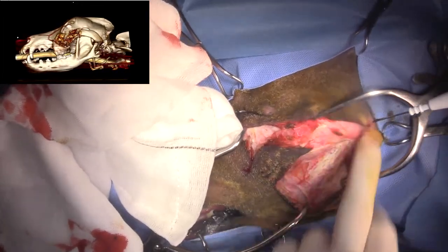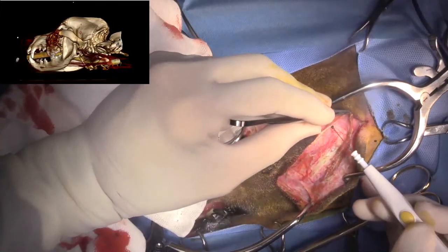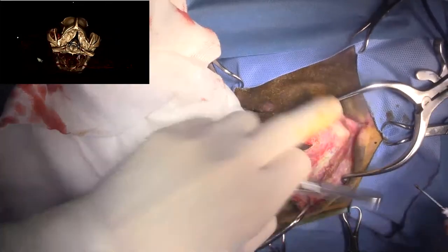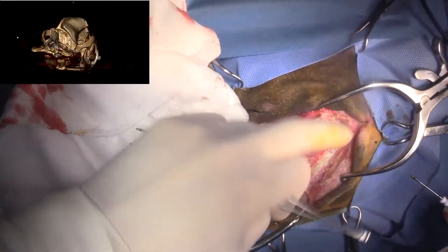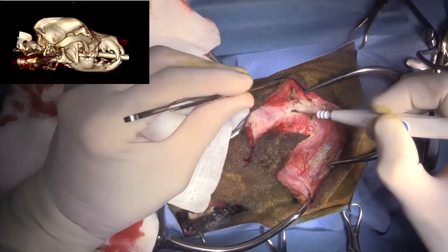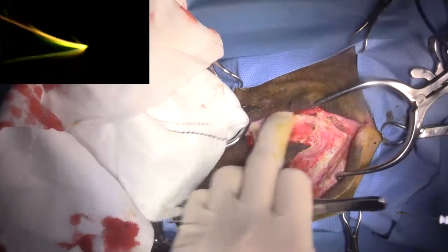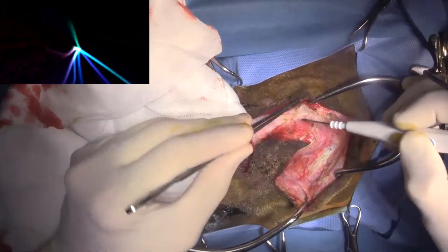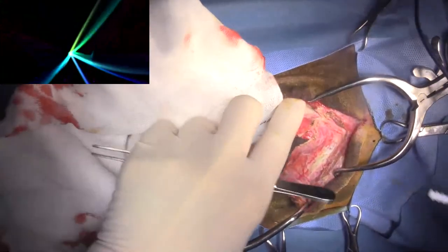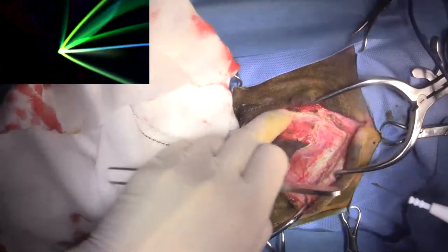My facial nerve, or palpebral branch of the facial nerve, is going to be right up in here. I might be able to preserve it. I think it's right there. And I'm getting down to the zygomatic ligament right there that makes the lateral margin of the orbit, attaches the zygomatic arch to the frontal region.